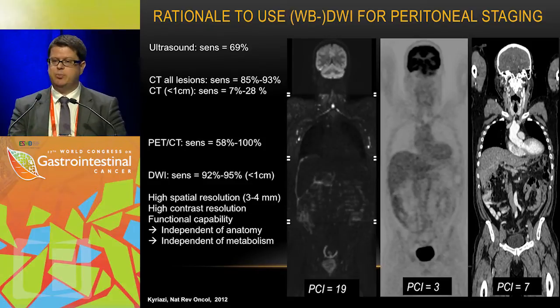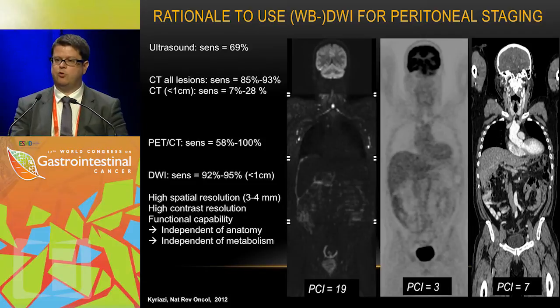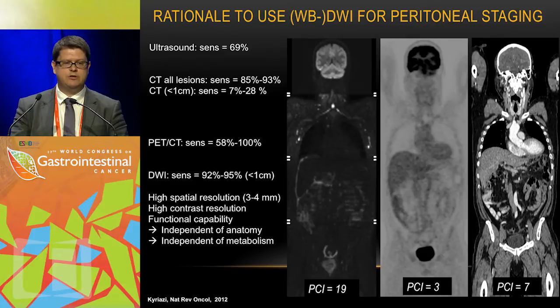What is the trick in this patient? It is a patient with a mucinous colon carcinoma, first of all, not easy to detect by PET, and also a patient after neoadjuvant chemotherapy. And this shows the advantage of the technique, both for primary diagnosis, but also able to stage the patient after neoadjuvant chemotherapy.